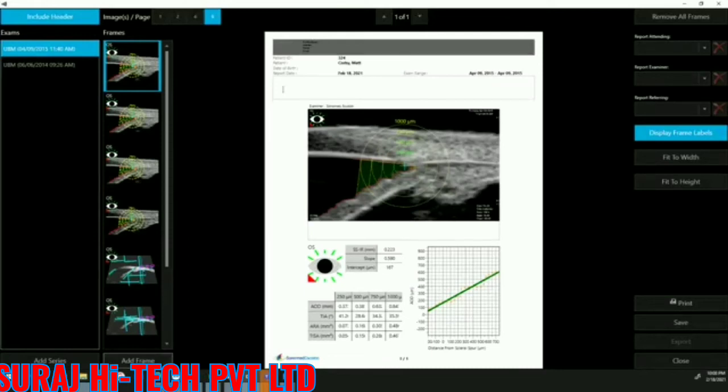It will provide you an image with the four rings, the table below with all the numbers, and the graph. So it is a very nice tool if it's a glaucoma patient who comes for treatment twice a year. You can always track and compare. So it is a truly great tool.